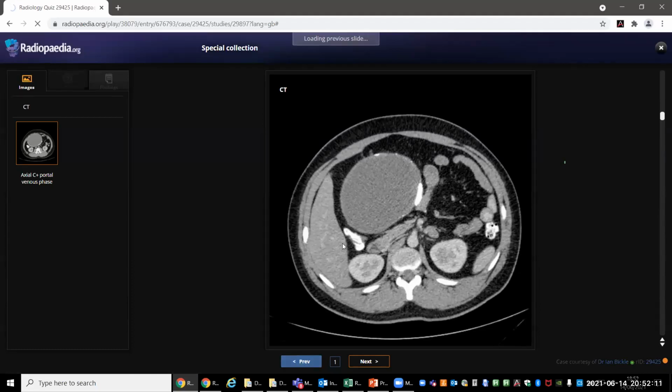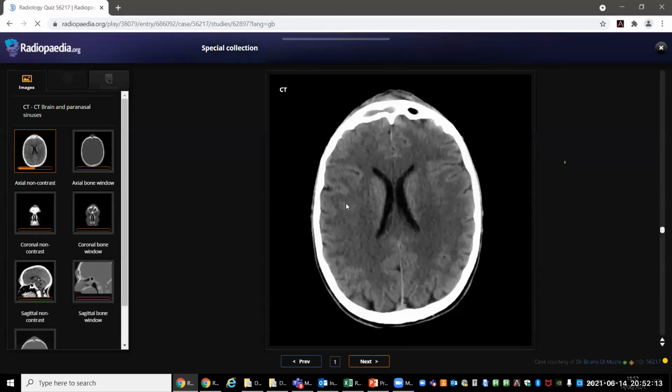And then the first case, which was the Pott's puffy tumor, you did it well. You said all the right things really. You do a contrast enhanced study or you do an MR because you want to look for any subtle intracranial involvement, such as meningitis or empyemas, so you want to look out for that.